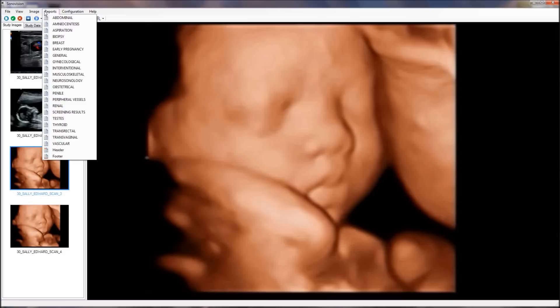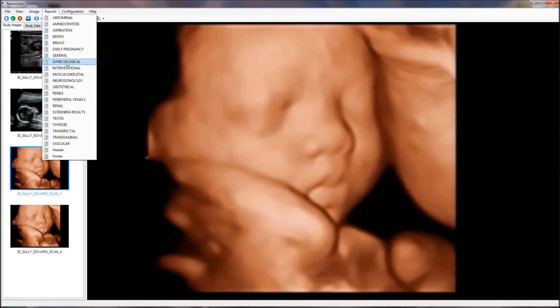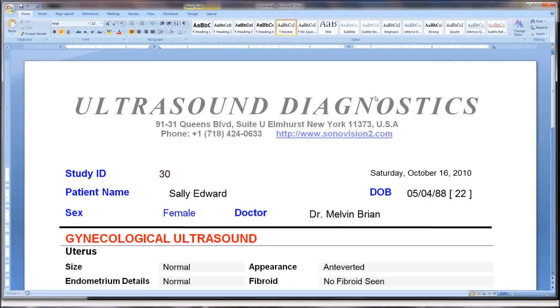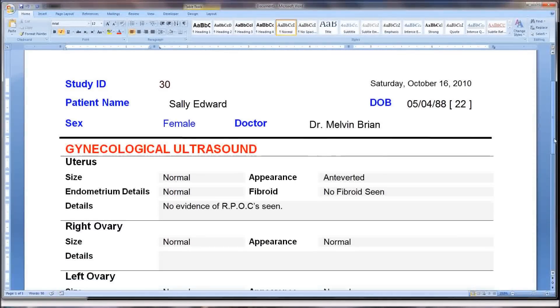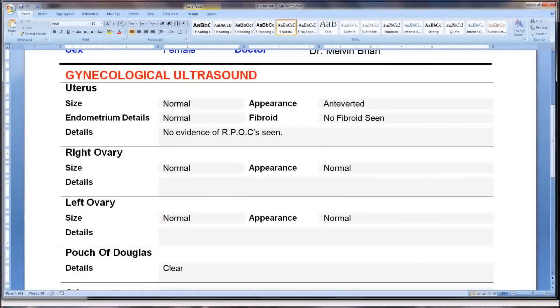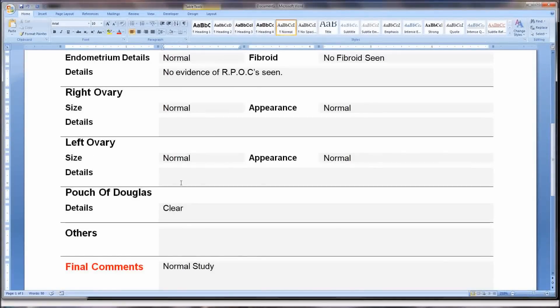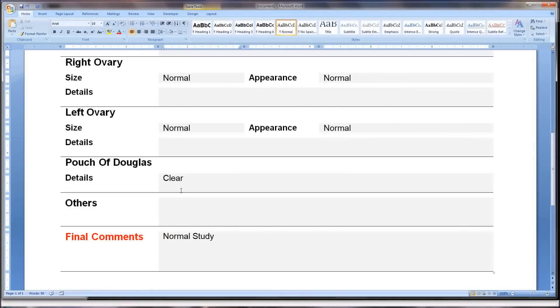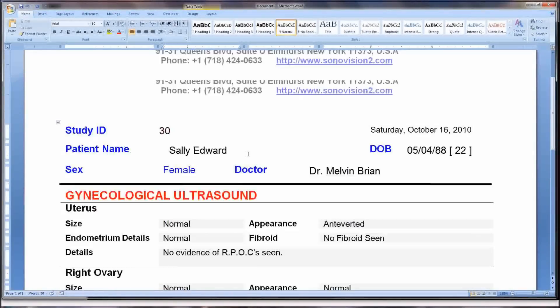Sonovision also has some built-in, customizable report templates, so a doctor can easily send study data into a report template and start writing observations in the patient's report.